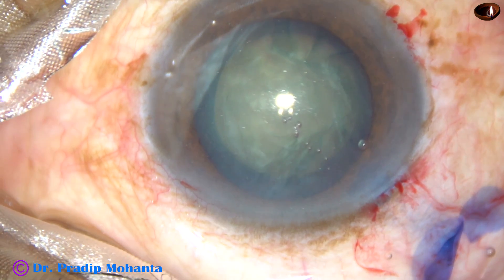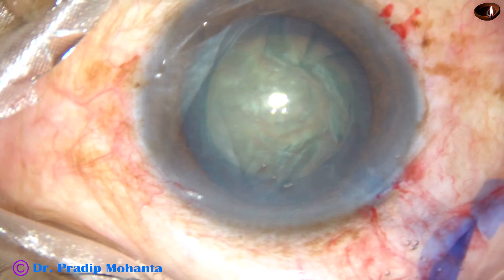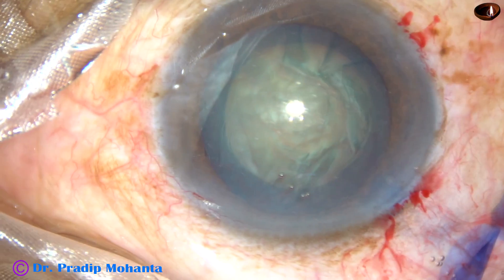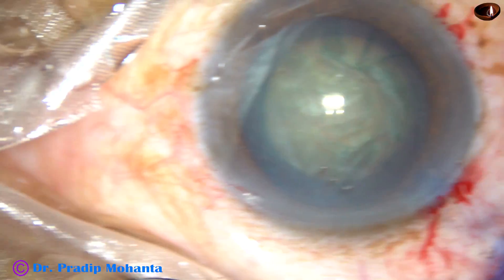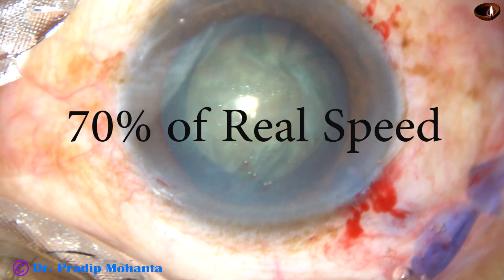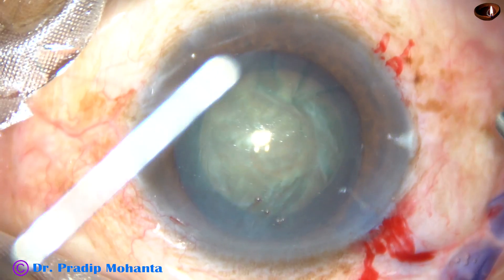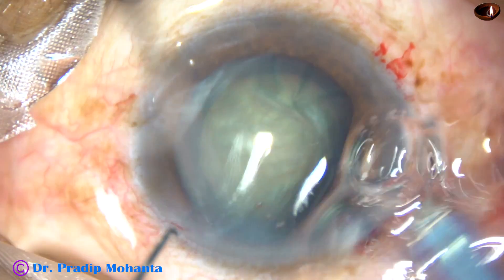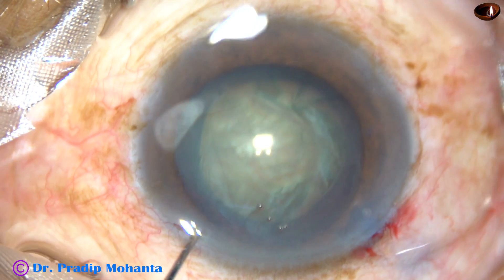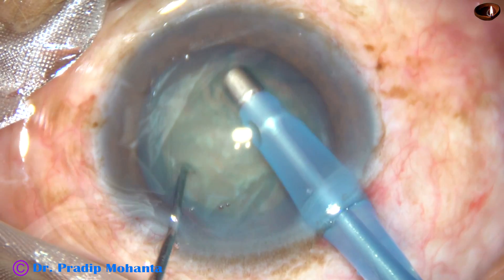By this time, after the initial steps, hydrodissection has been done. The nucleus has been rotated. And now, the tip of the phacoemulsification is being introduced. From here, you are going to see the surgery in slow motion. Enter into the anterior chamber, bevel down.